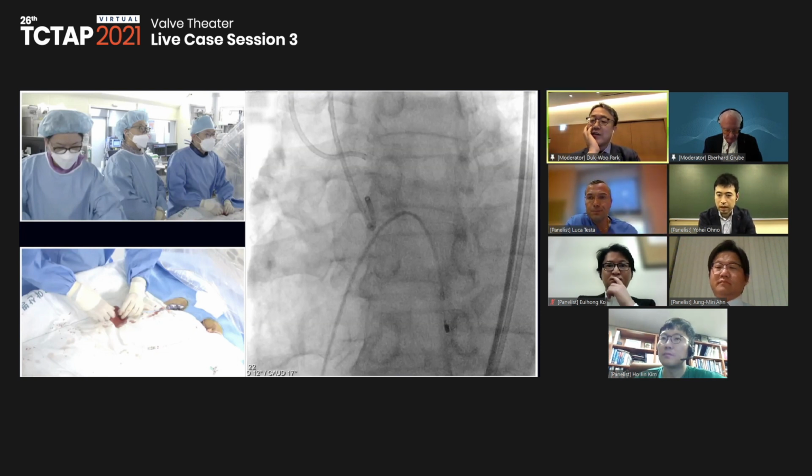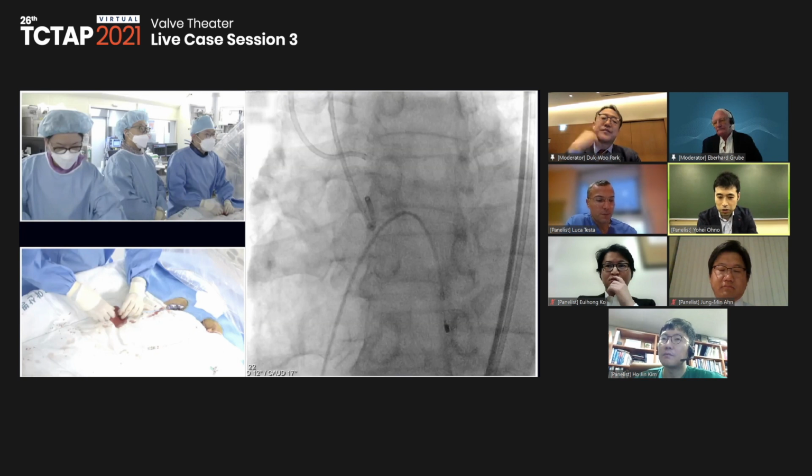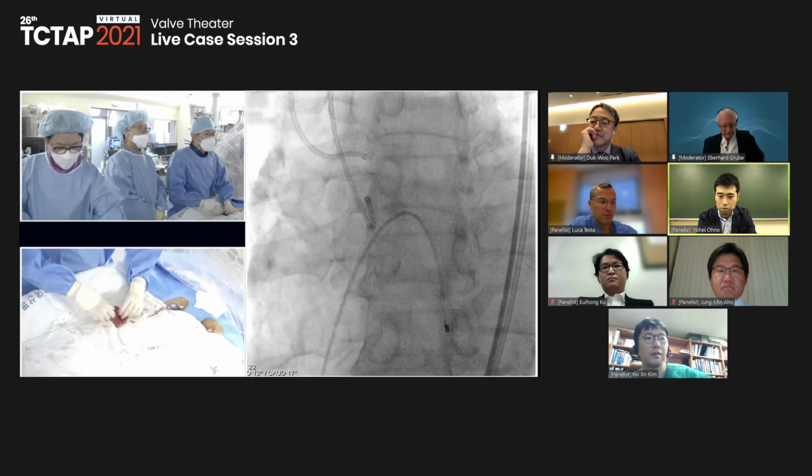Okay, great. And Yohei, how do you think? Yeah, very important question. Well, we've been doing 3D echo also, but the major drawback is that it lacks information on calcification. So if the patient's creatinine level is below 3, we made a specific internal protocol using low dose contrast media, almost 30 milliliters of contrast, and our technicians would nicely perform a CT scan.